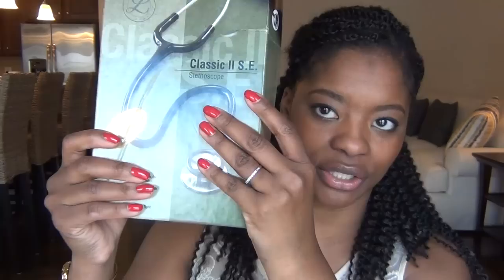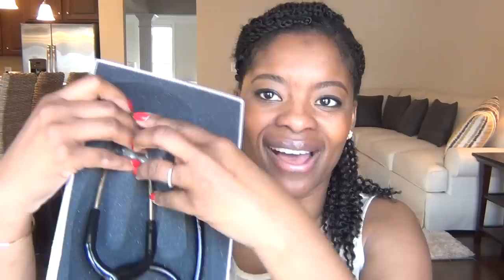I still have the box — not really sure why, but I do. It came with a little booklet and extra ear tips. I've used this stethoscope for the last few years; it still works perfectly fine and everything's intact.